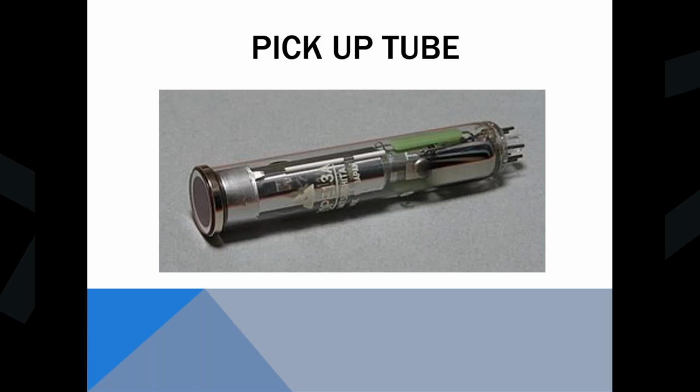The only drawback to the pickup tubes was that they took a while to warm up. So if you had to run someone in for a quick exam, the image quality was really bad until they got to temperature. And some of the earlier ones had a digital lag, or a lag to the image. So as you stepped on the pedal, you weren't seeing it in real time. You were seeing an image that was, I don't know, a few seconds older than what you were actually doing, but that improved over the time that they were used.